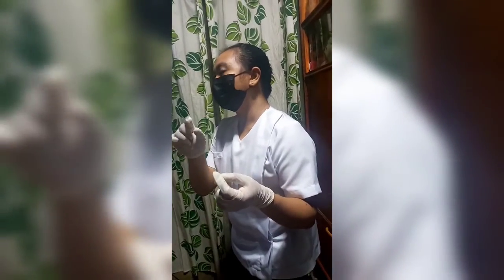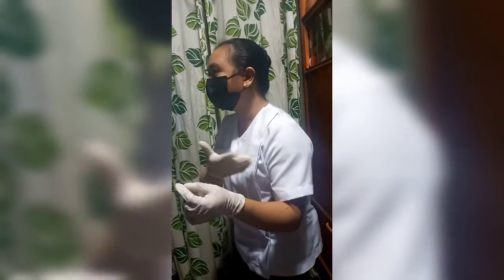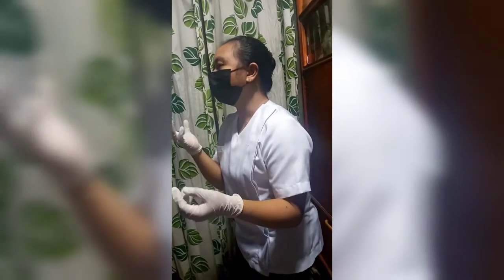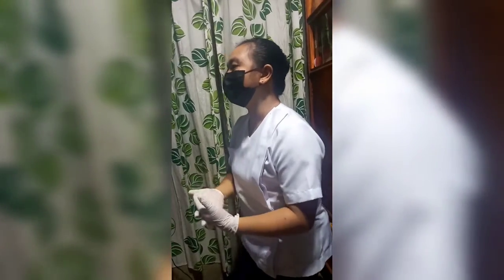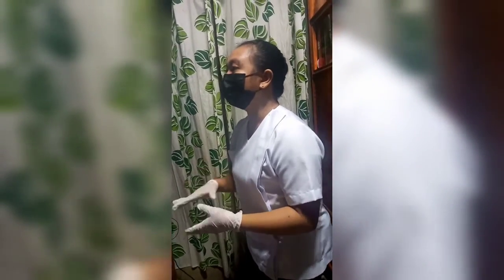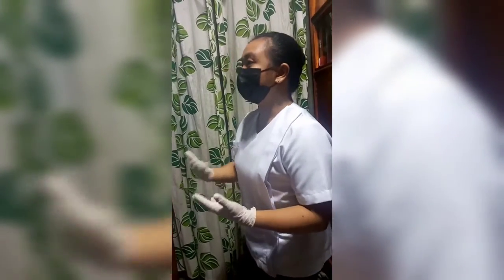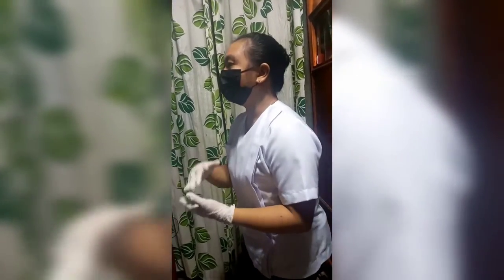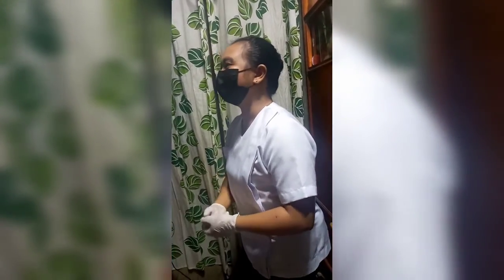Tapos, yung tube po na nakakonekta doon ay magdadaloy ng oxygen na i-inhale nyo. Itong procedure po na to ay makakatulong lalo na kung mababa ang oxygen natin sa katawan. Ito po ay nakakatulong sa pag-maintain ng tamang level ng oxygen sa ating katawan. Kung matakot, hindi ka po masasaktan sa procedure na to.